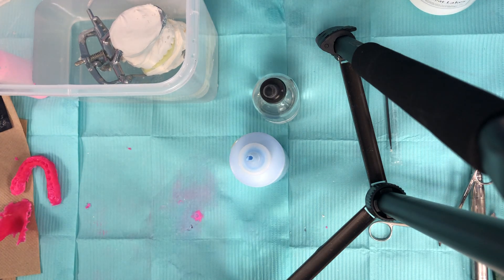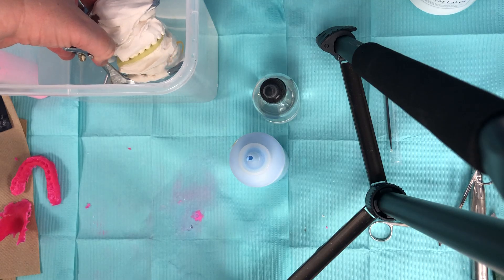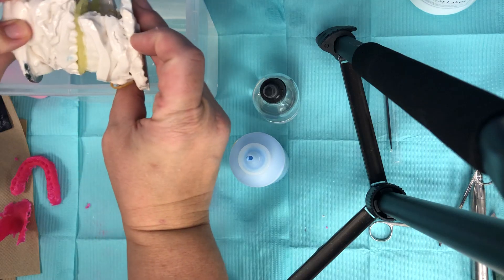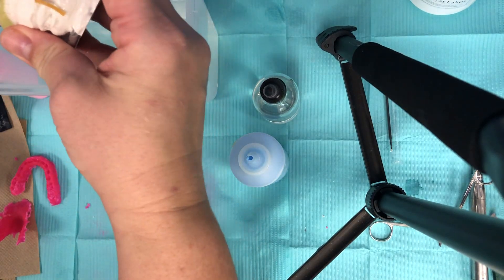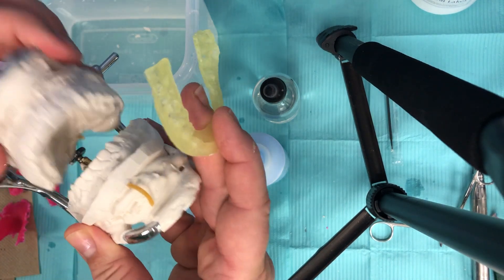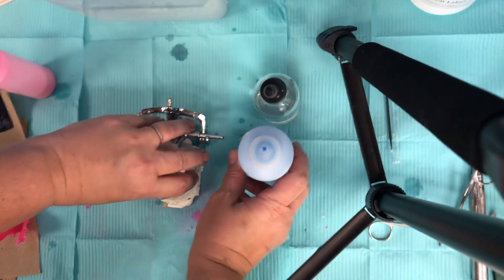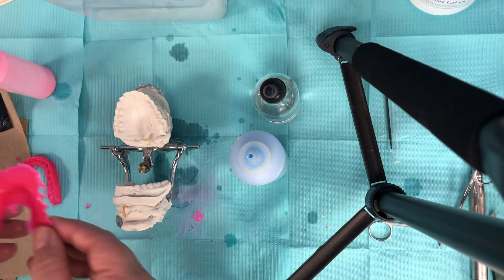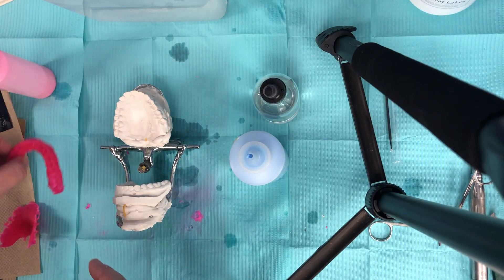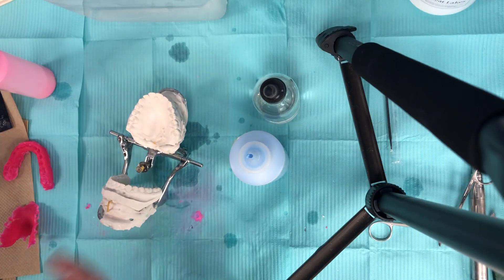Good morning and welcome back to splint construction and working with monomer and polymer to create acrylic. Today we're going to be going over how to make an SRS, Superior Repositioning Splint. For the last five minutes I've been soaking my model in water just to make it easier when I take the splint off. We have mounted these models together and on the previous videos I made the pink retainer and yesterday I made the pink splint, but today we're gonna jazz it up and make a pink and blue.